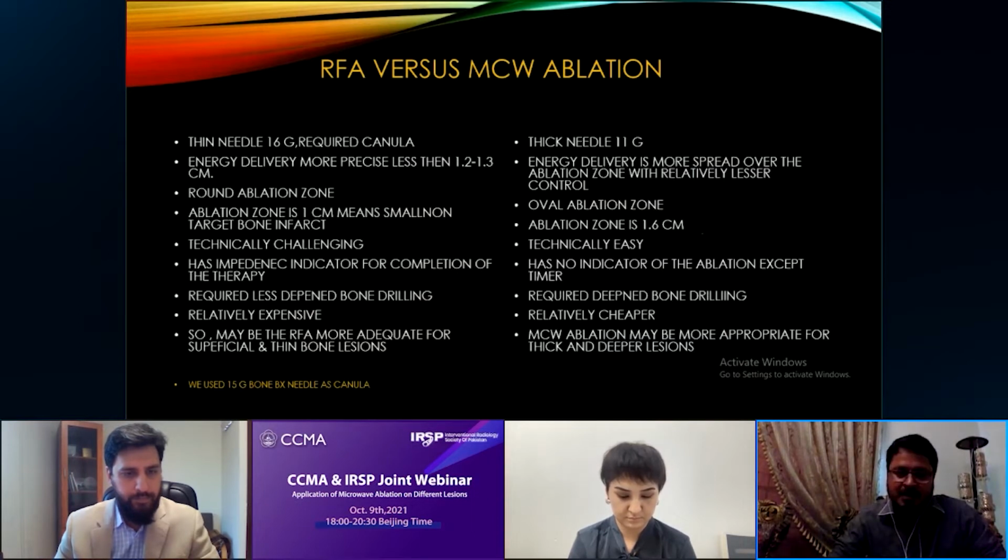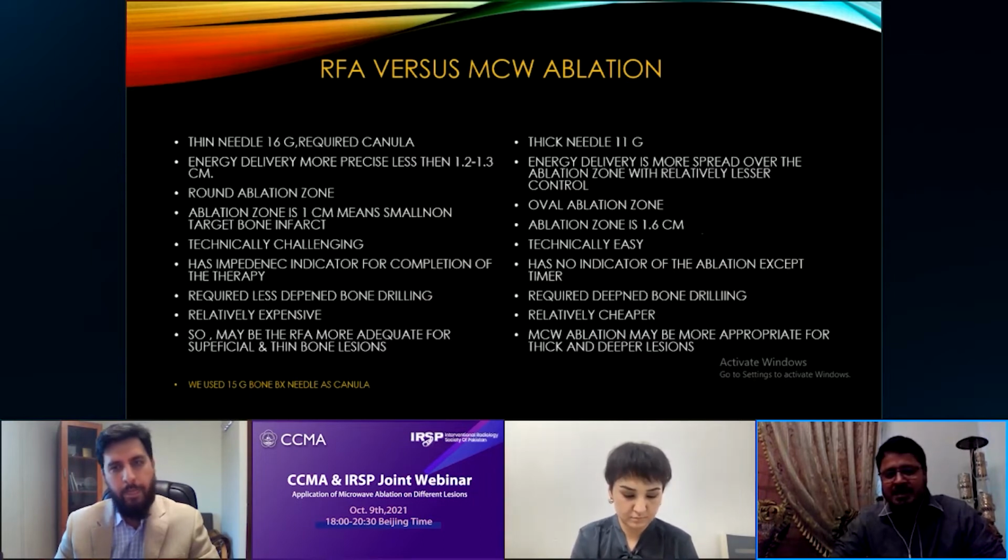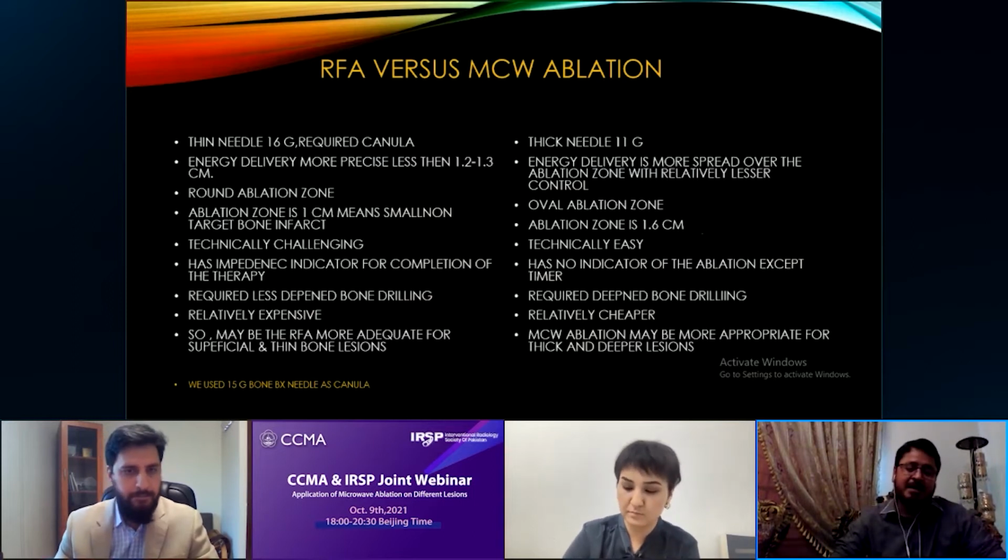I will show a couple of papers, but in our experience of 8 to 9 years, we did all cases of osteoid osteoma with radiofrequency ablation before 2017, and we didn't have access or availability of microwave ablation antenna. Then in late 2017, microwave ablation arrived in Pakistan for bone ablation therapies, and we adopted this technique. And since then, we are doing RFA and microwave both.